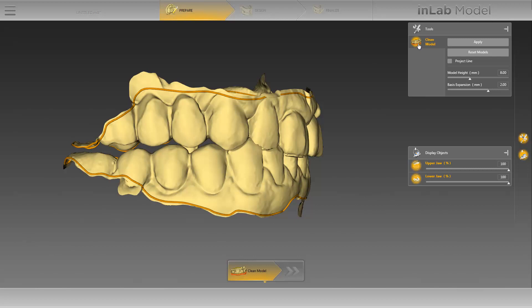We adjust the height to 11 millimeters. You can do this by either moving the slide controller or entering the desired value directly into the corresponding field. Aside from the height, you can also define the width of the model base. We will calculate our model using an expansion of 2 millimeters, and start the process by clicking on Apply.